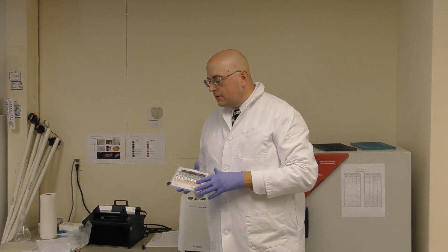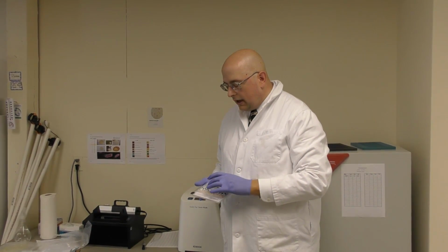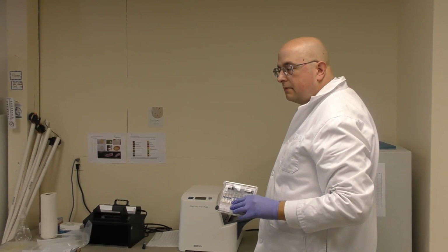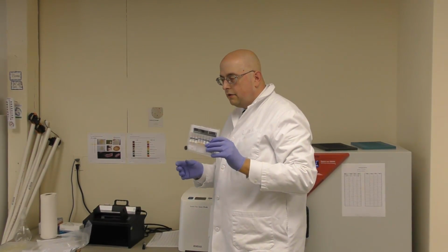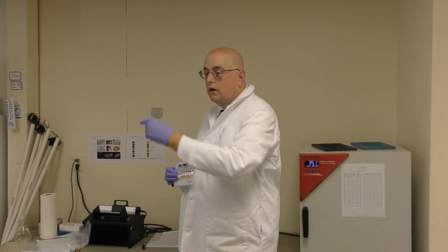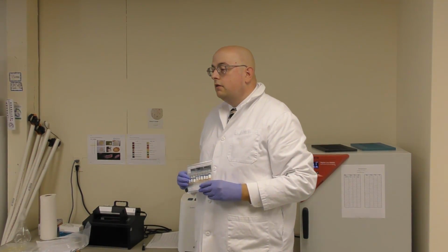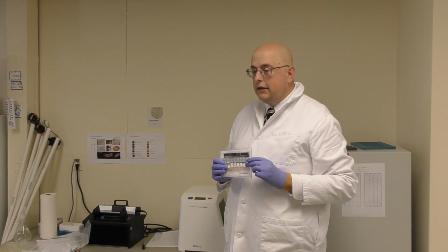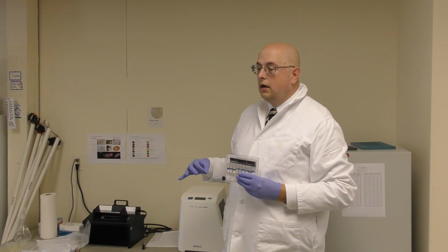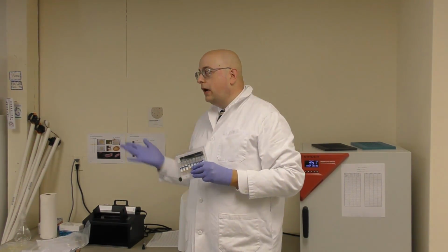Okay. And the way the procedure works out is you take each vial, E. coli, Pseudomonas, and Klebsiella, warm it up in the incubator for about 10 minutes or so, just because it came out of the freezer. And then dump the contents of that vial into a bottle filled with your bacteria-free water, and then process it as a normal sample. The bacteria concentrations in here are of a known quantity, and that's again to verify the technician's technique, and it also checks to make sure there's no contamination with the water you're using, as well as the media that you've purchased.